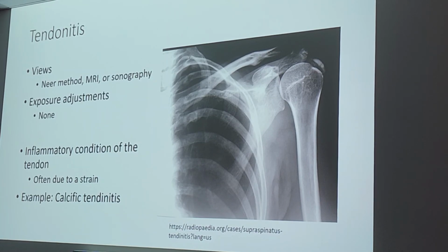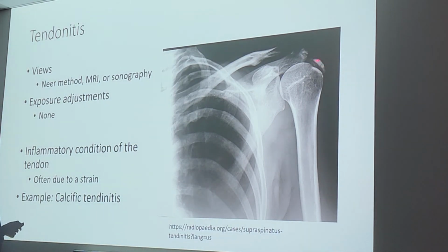Do you see it? Where is it? Do you see that calcified tendon? That's right. It's this line right there. That inflamed calcified tendon.